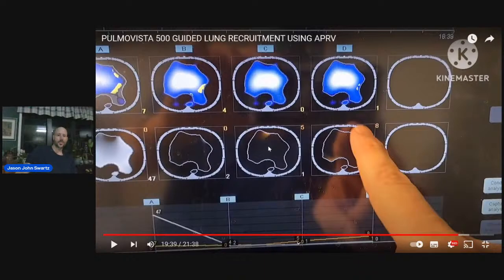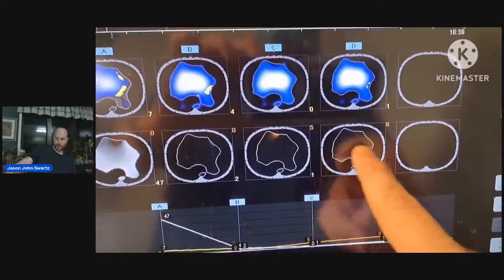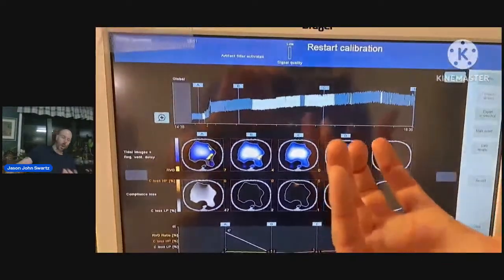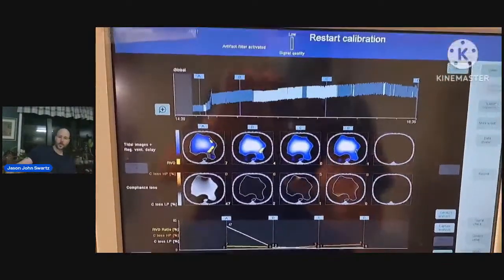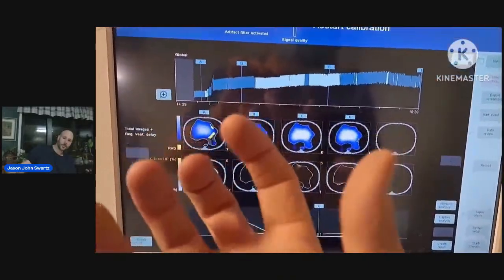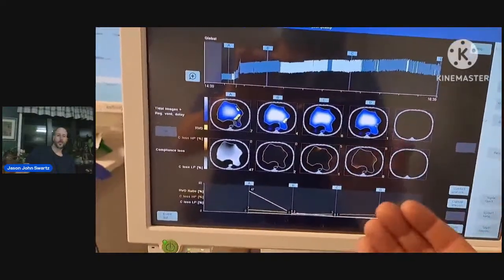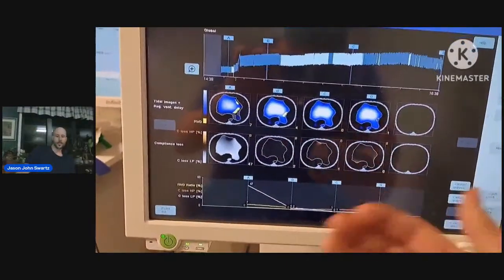When you start losing, you're always going to start losing around the edges. You're not going to lose a blotch in the middle often. It's always the edge of the aerated lung, areas that are getting over distension. So by dropping it, the lung is over distending because things are starting to close up. So really this guy needs to pretty much stay around 30 to 28 P high for now.